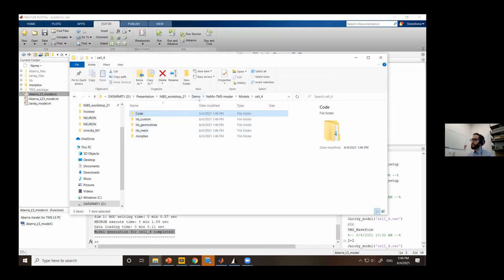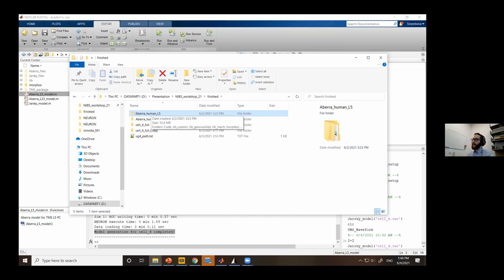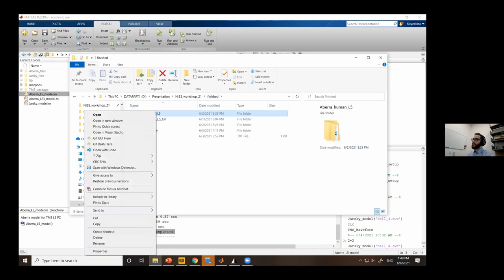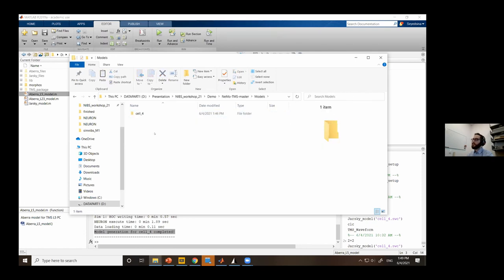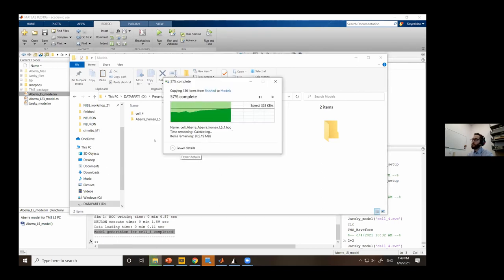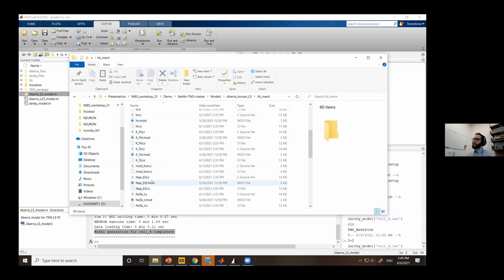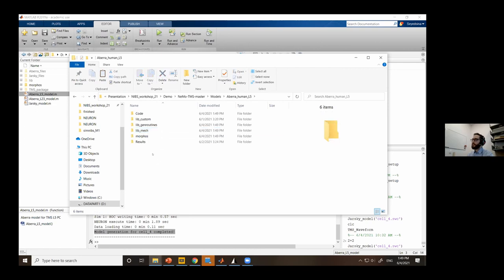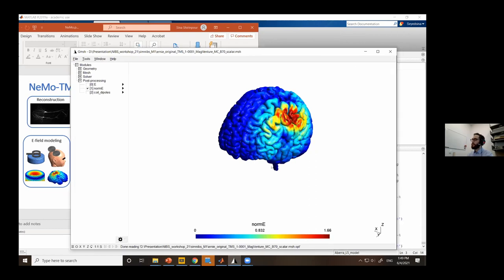Now that we have a layer 5 neuron model, let's couple it with an electric field model run in SimNibs. As you learned yesterday, I've taken the Ernie head model — an example from SimNibs — and placed a TMS coil over the motor cortex. The electric field is mainly focused around the motor cortex area. I want to place a neuron inside the motor cortex and simulate what happens. I need the mesh file output from SimNibs as the electric field model. I also need to export the 3D neuron geometry in a format the coupling step can use.